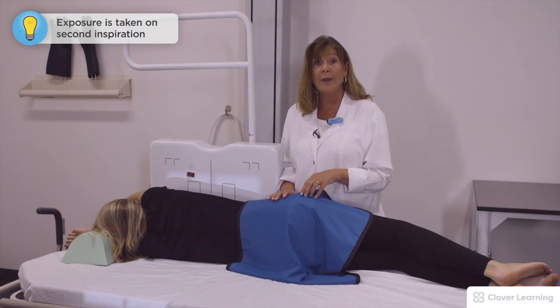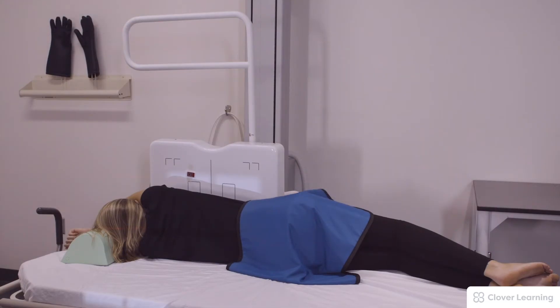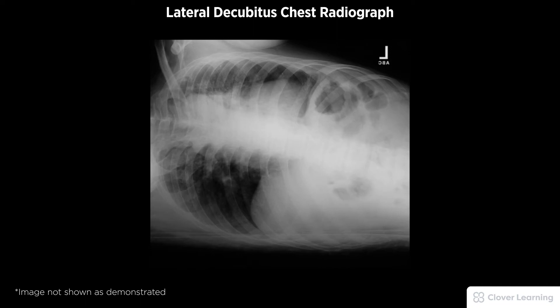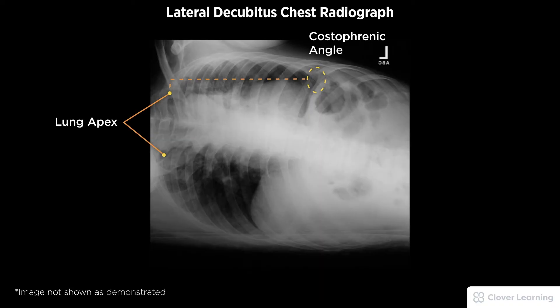The patient will hold very still. We will have her take in a big deep breath, blow it all the way out, take in another big deep breath, and the exposure is made. A diagnostic lateral decubitus chest radiograph should be free of motion and rotation and demonstrate the entirety of the affected side, to include the lung apex to the costophrenic angle.